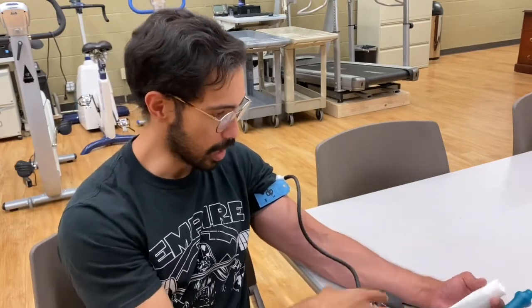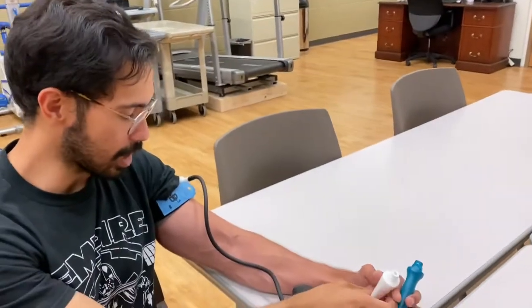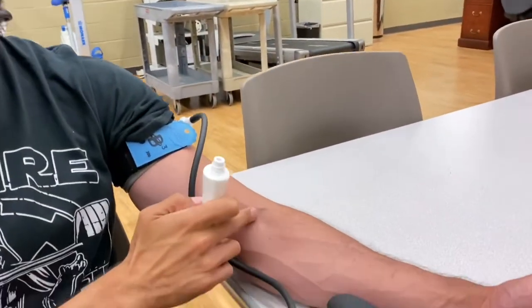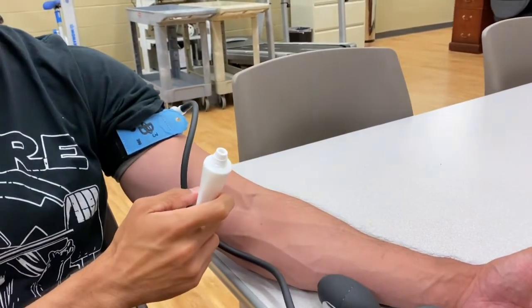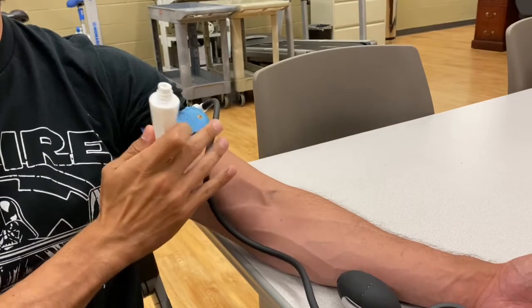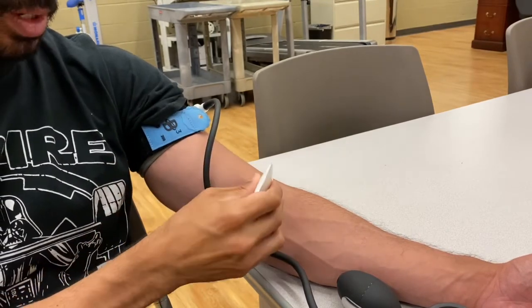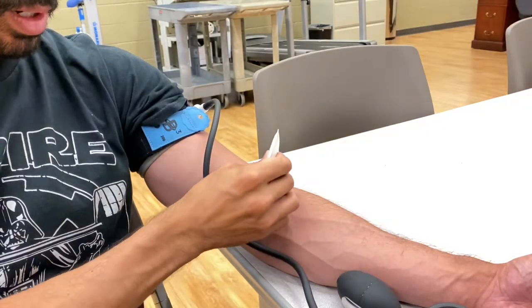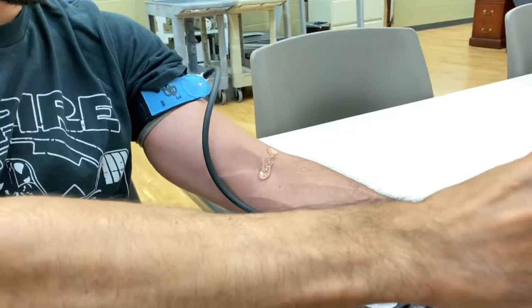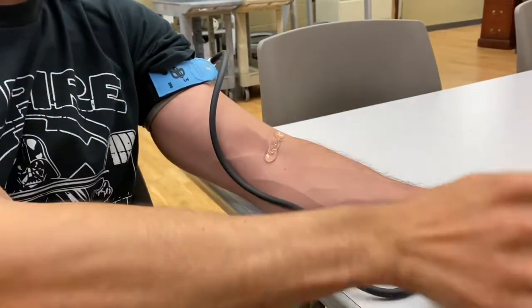So we have the ultrasound gel. We're just going to require a little bit of that right on top of the target area. You can see the big vessel right here. That's the median cubital vein. We don't want to go for a vein. We're not going to be measuring blood flow in a vein because when we're doing BFR, we want to cut off all blood flow in there in the first place. So we want to try to find the artery. So I'm going to put a wide swath of ultrasound gel there, and we're going to try to find the best signal for the sound of the brachial artery.